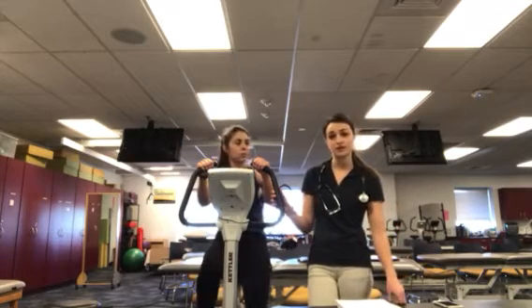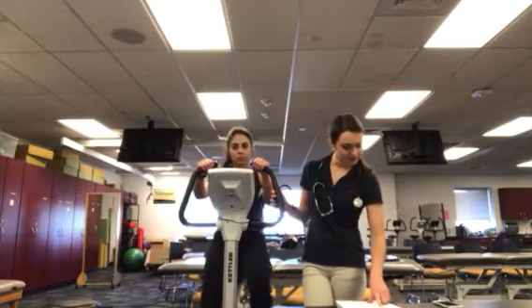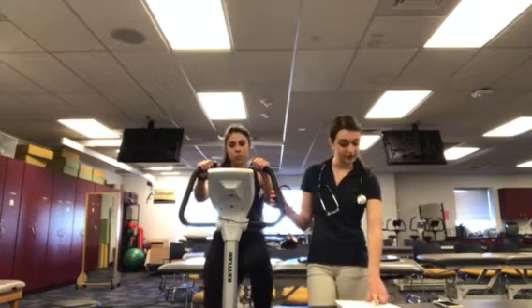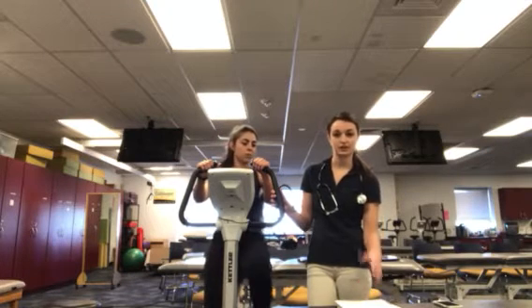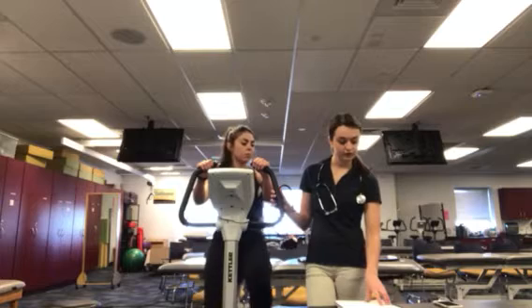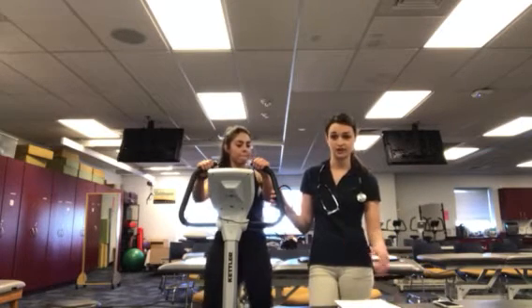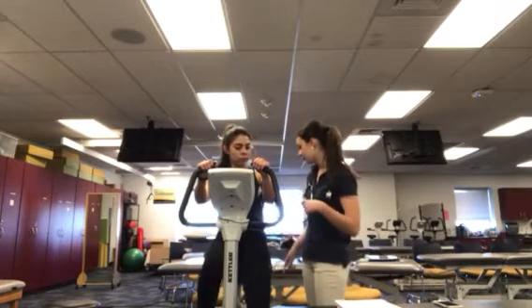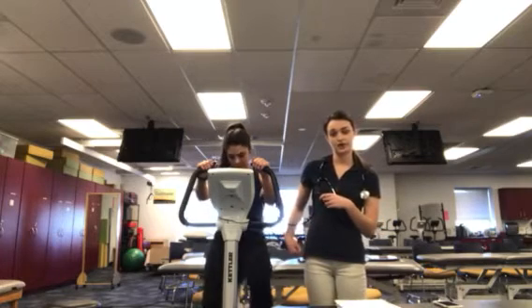Before we started the test, we took Brooke's resting vitals. Her resting heart rate was 62 beats per minute. Her blood pressure was 115/72 millimeters of mercury. And her RPE was a 7 on that scale. These are within the normal ranges for Brooke, so we saw no need to not start the test. So we did start the test normally. We also adjusted her bike seat before she started so that she's comfortable throughout the test. It sits right at her greater trochanter.